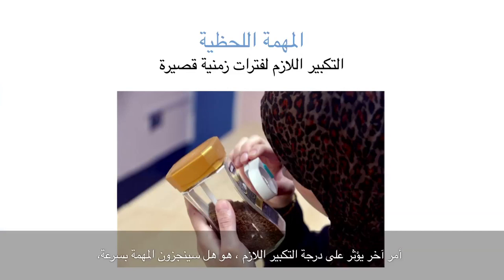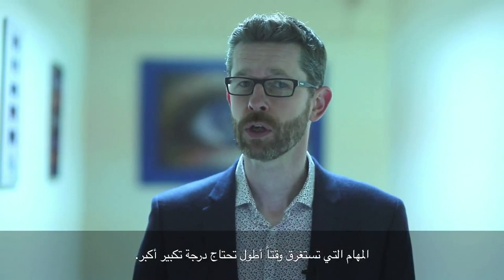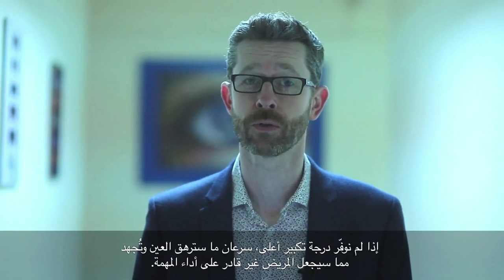Another thing that will affect how much magnification a patient may need is whether they're looking to do a task very briefly, a task which we call a spot task, such as reading my watch or reading 2 words on a bottle to identify what's inside it, or whether it's going to be a sustained task, something we're going to do for longer, reading a letter or reading a few paragraphs in a magazine. Tasks that we're going to do for longer will need more magnification. If we don't allow more magnification, the eyes will tire more quickly and become fatigued, and the patients will very quickly stop being able to do that task.